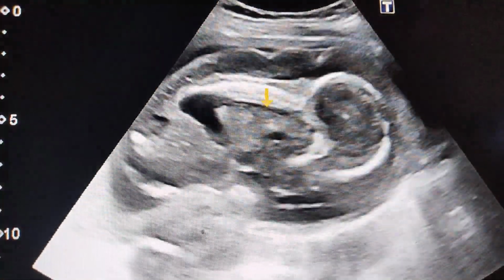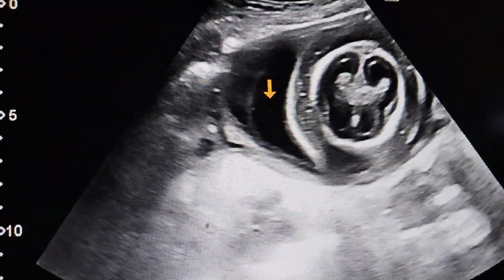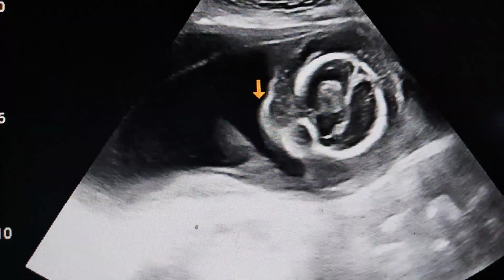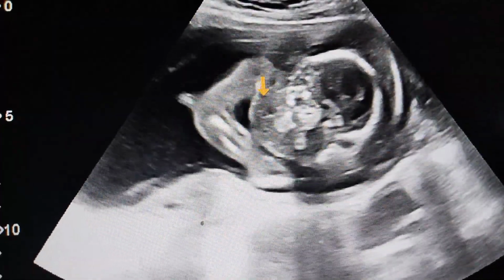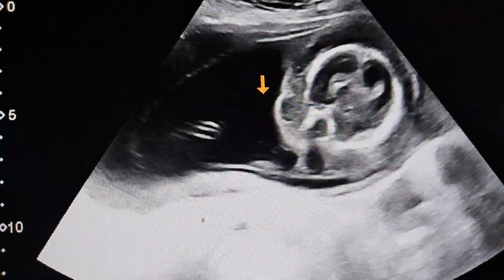I have seen that this is almost 18 weeks gestational age, and at this age there is Hydrops fetalis, so likely it is the non-immune Hydrops fetalis.